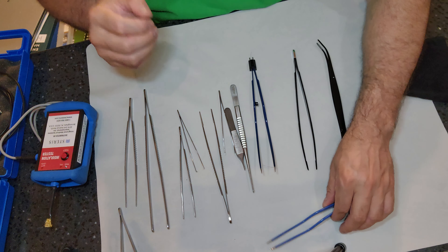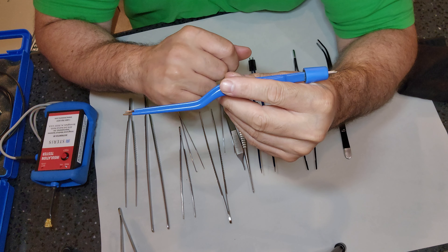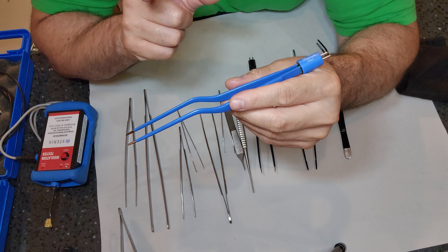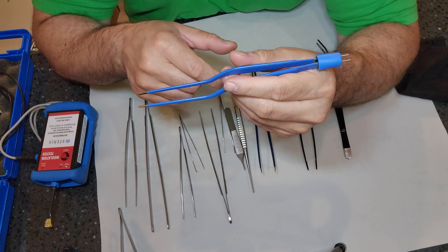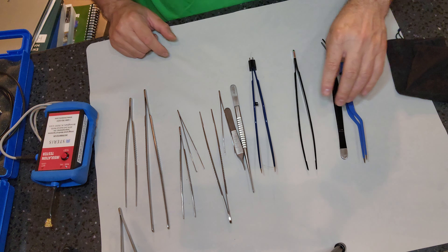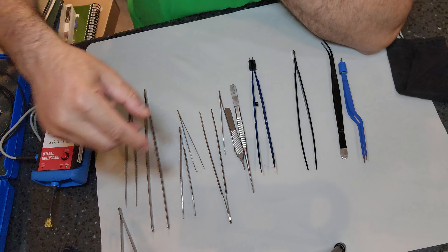One last quiz: this type of forcep — how do you think it should be handled? Like this, or like this? Put your answers in the comment section and tell me why it's this way or that way. As always, stay true to yourselves, keep it 100, continue educating yourself. Until next time — peace.